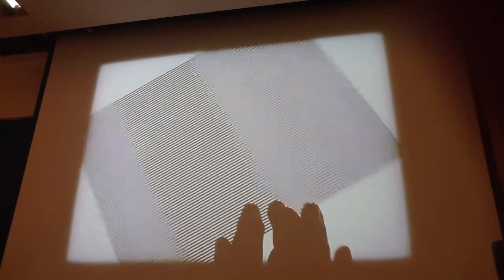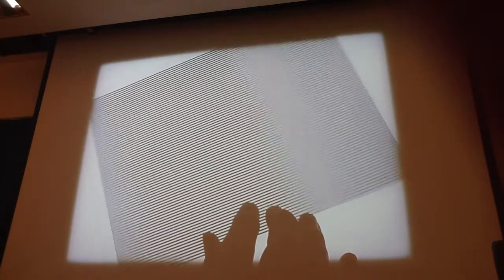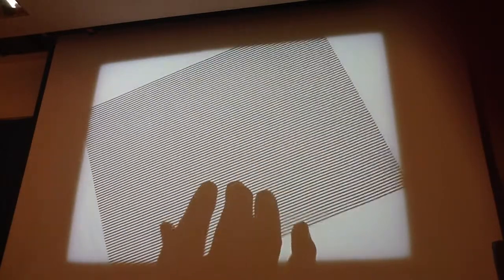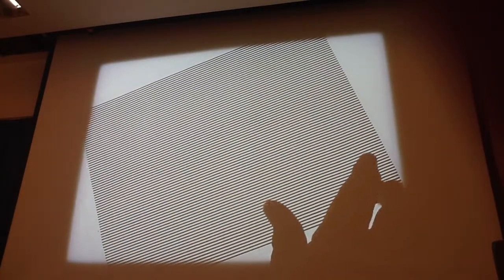So trying to see if I can get it to do it. You can see that sometimes I can do it for a temporary thing here. What's happening is that if it's scanning at the same frequency as the lines here, then it creates that problem.